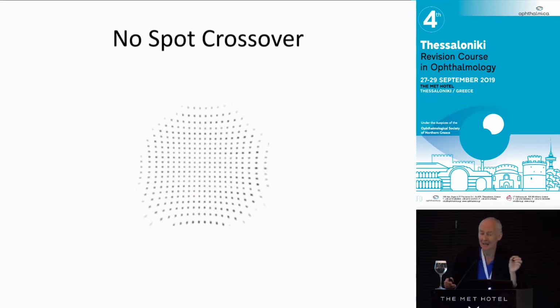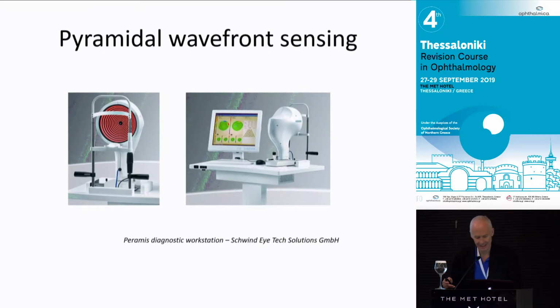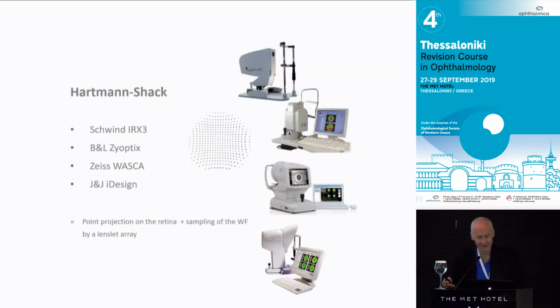And it knows where the spot of light is supposed to emerge, if it's an ideal wavefront. If the ray of light is deviated to one side or another, the distance of deviation from the ideal locus gives you information about the wavefronts. That's how Shack-Hartmann sensors worked, and they were the basis of most common laser systems until recently.